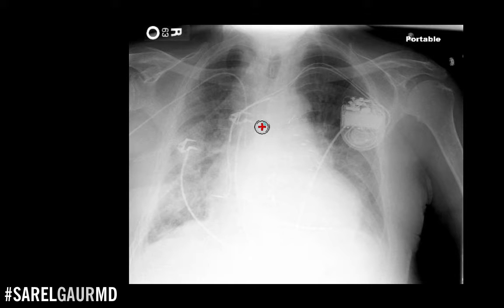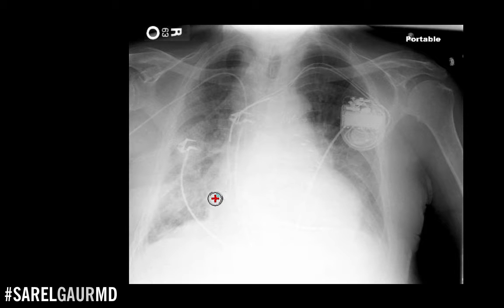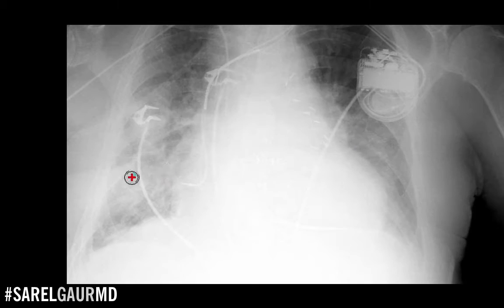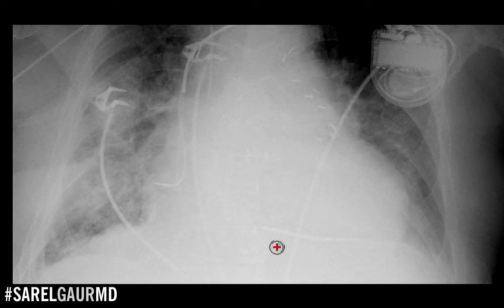Inpatient, multiple priors — go. So first thing I'm doing is lines and tubes. I'm seeing this high-density catheter here — this is a PICC line, termination in the SVC, so that's okay. I'm seeing a cardiac device here; I'm looking for the leads. I see a lead going into the right atrium region, so that's okay. Then I see another lead going and terminating in the right ventricle.